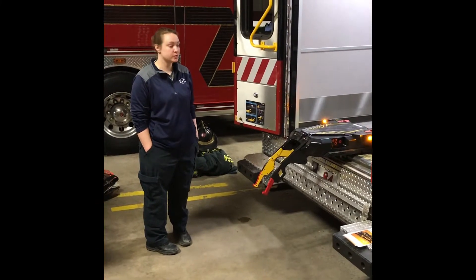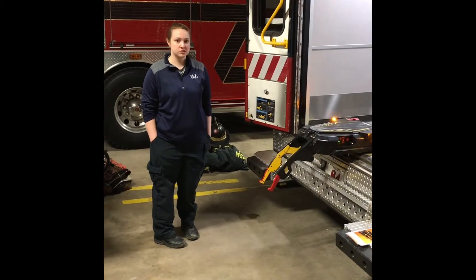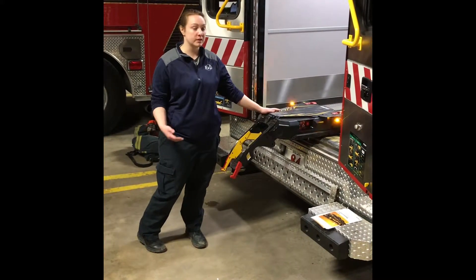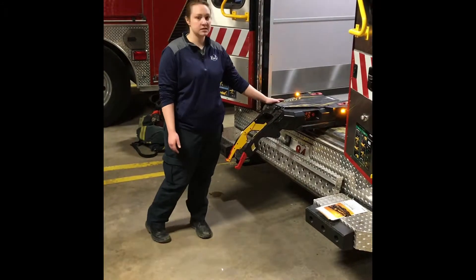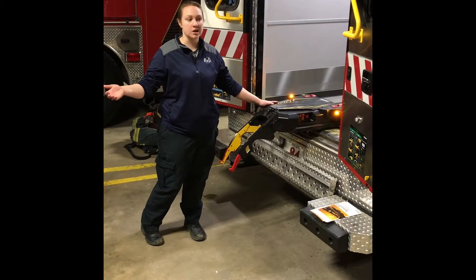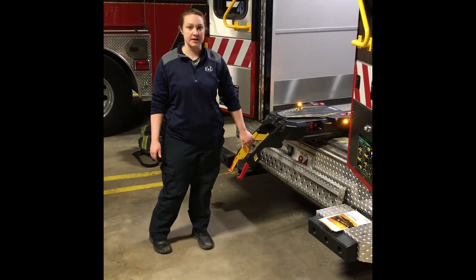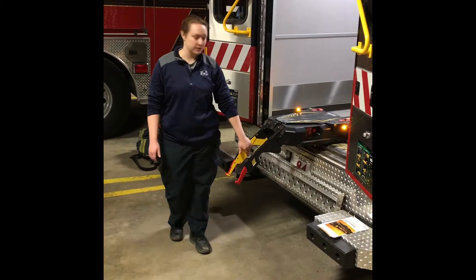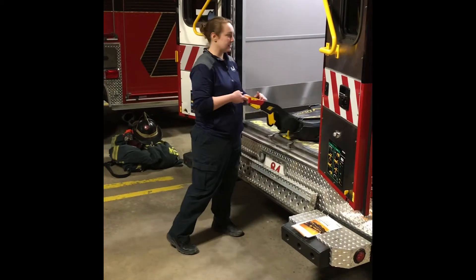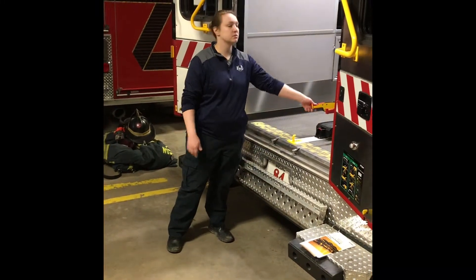Now we're going to talk about troubleshooting some issues that may occur with this load system. You want to make sure the track and system are in the right positions before you load and unload. After unloading the cot and transferring a patient, before you close the doors, push the track back in. To do that, simply lift up on the arms until you hear it click, then push it back in until it's out of the way. Let go of the arms and you can close your doors.